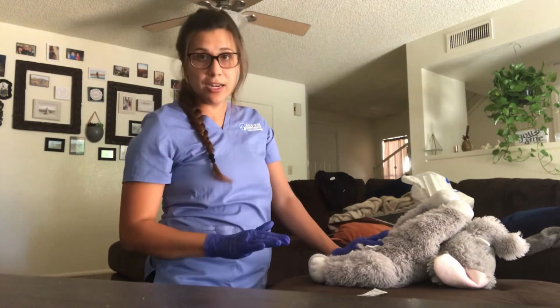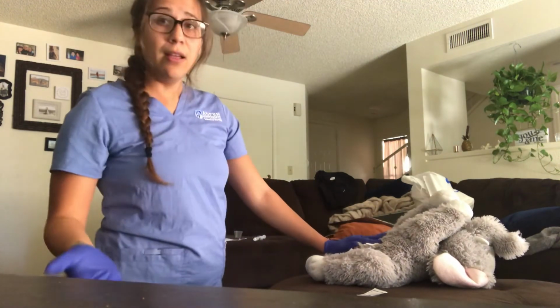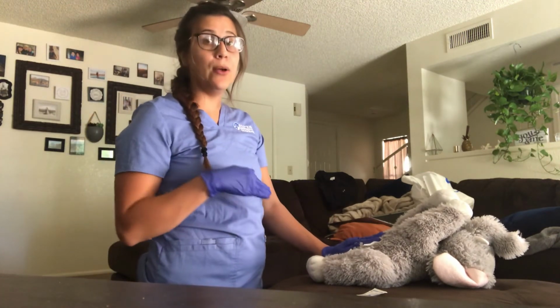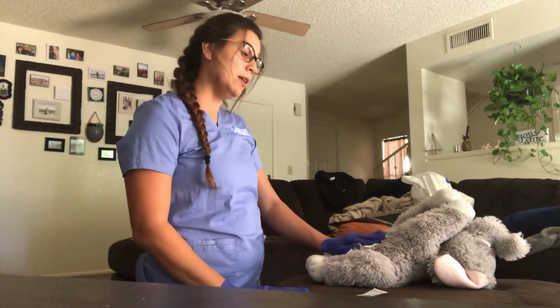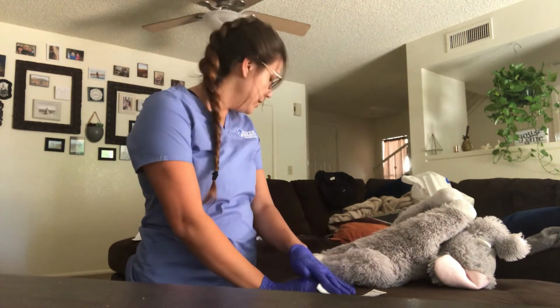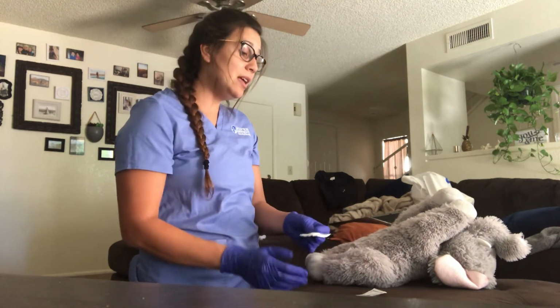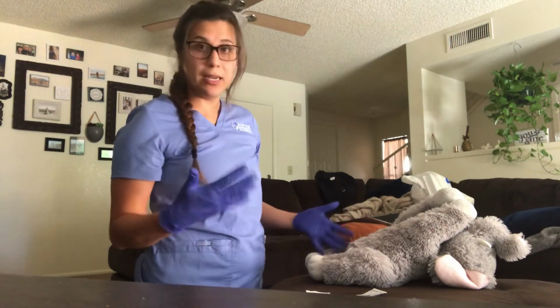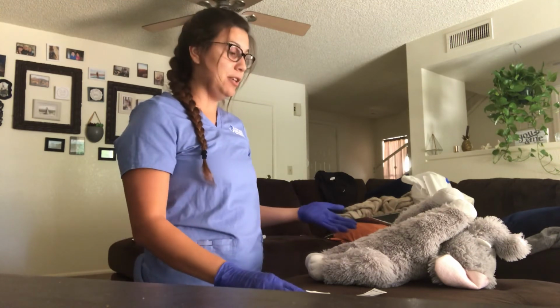Now you're not massaging it, you're putting gentle pressure on it. If this was heparin, you're going to want to put gentle pressure on it for about 30 to 60 seconds. But this patient wasn't getting heparin, so if the patient was still bleeding, you could always give them a Band-Aid. And then you want to stay with the patient for several minutes because you're checking for an allergic reaction to the injection that you just gave them.